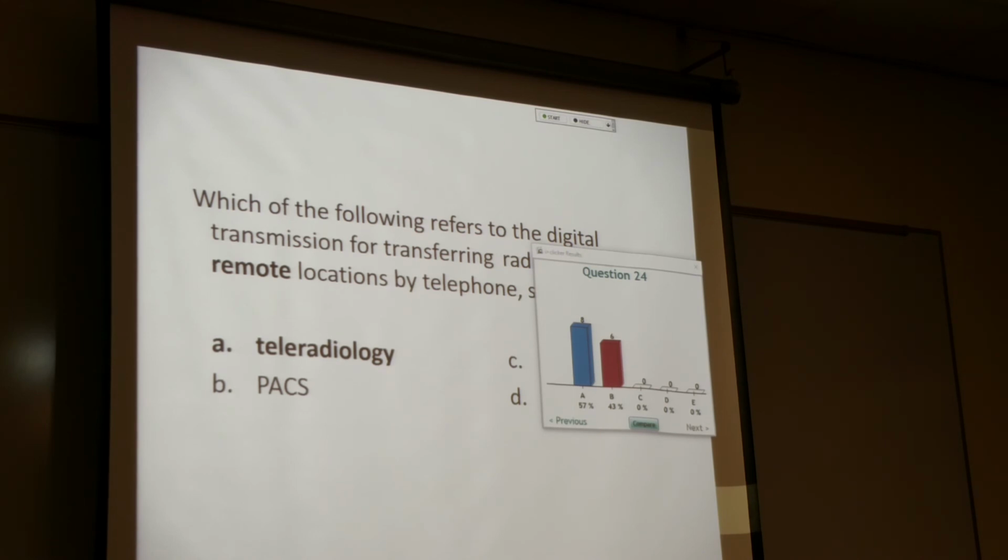They can pull it up through the email or internet or their own link into our PACS system at the hospital, and they can look at those images, call the ER doctor, and tell them what needs to be done. Or call the specialist to come in, it is a fracture of the forearm. So the days of them traveling are over. Okay, they're all grumpy, that's hard on you, but guess what? The patient who broke their arm, who needs to go to surgery to have an open reduction, is having to wait until the team comes in. Part of the wait is the radiologist coming in to read it, as an example.